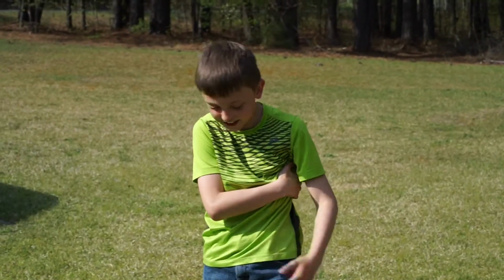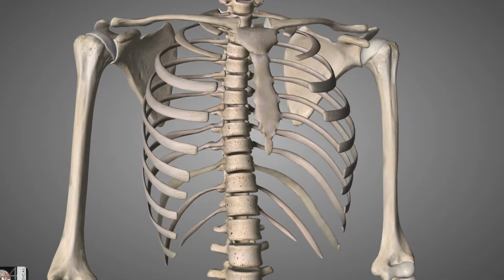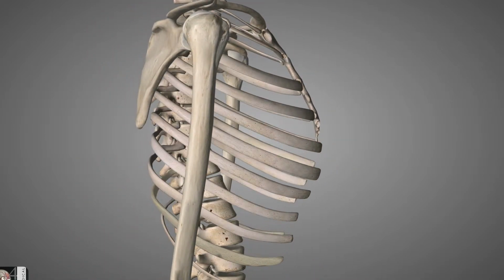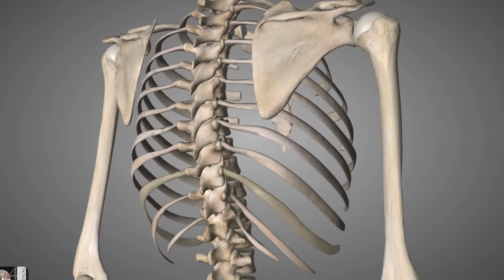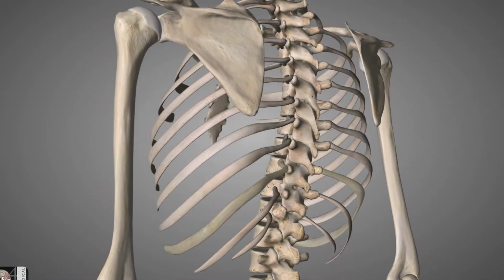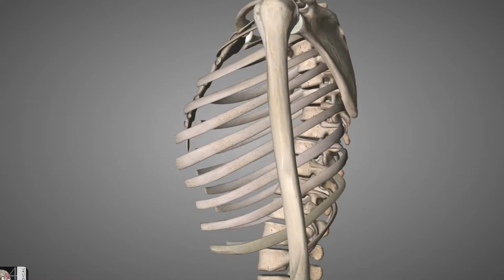My ribs hurt. I need to get an x-ray. So it's important to ask the patient where their pain is because it will determine their position. For example, if they're hurting posteriorly or on their back, you're going to put them in an AP position. Vice versa, if they're hurting anteriorly or on the front, you're going to put them in a PA position. For the sake of the video, we're going to do everything in an AP position.